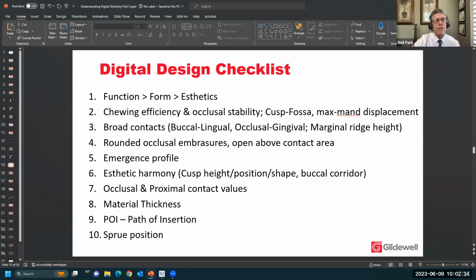Absolutely. I do have a couple questions for you. It looks like this idea of incorporating the post and build up within the crown is something that you do routinely. And obviously you don't have any mechanical retention in this, otherwise you wouldn't be able to have any draw. So do you have more faith in bonding materials than I have? I mean, you feel like these things are very stable and they're not going anywhere? I feel they're very stable. I'm really confident in our bonding protocol for zirconia restorations, which is to air abrade and create that micromechanical roughened surface and the proper chemistry.